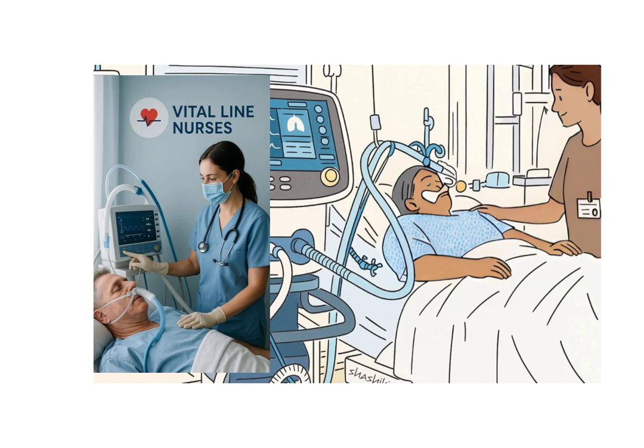Key nursing responsibilities. 1. Monitor the patient and ventilator settings. Always assess the patient first. Look for changes in breathing pattern, vitals, or level of consciousness. Then check ventilator settings to ensure they match the order.